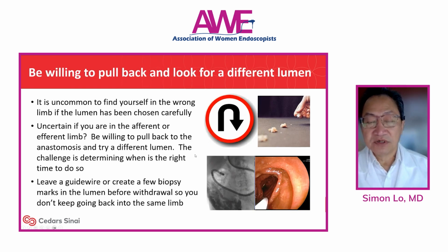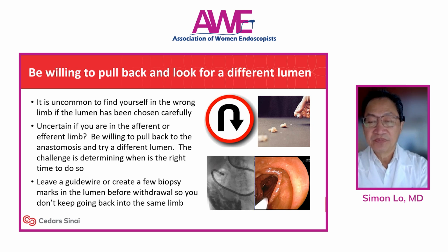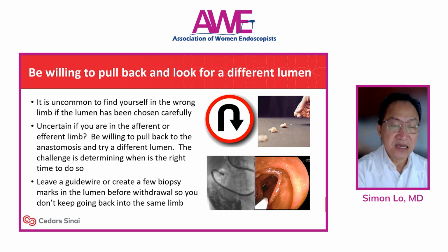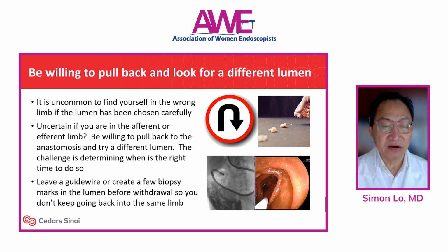One of the most difficult parts of doing an enteroscopic procedure is not knowing whether you have reached too far into the efferent limb and need to come back. That is something that you have to acquire the skill and the feel for. At the same time, there are some general rules of thumb.